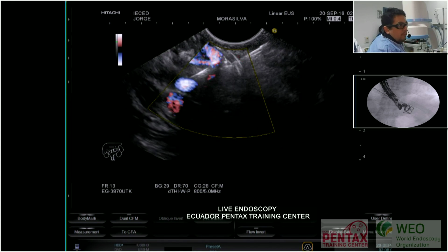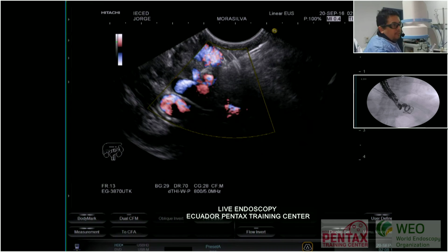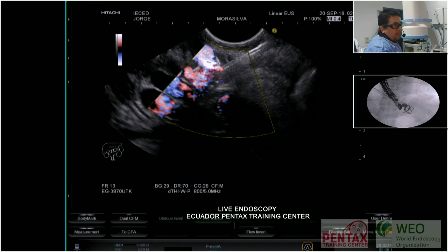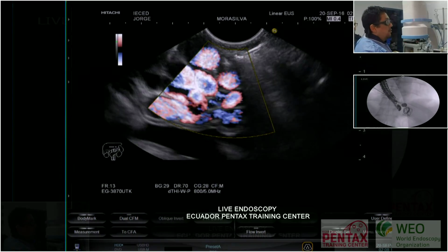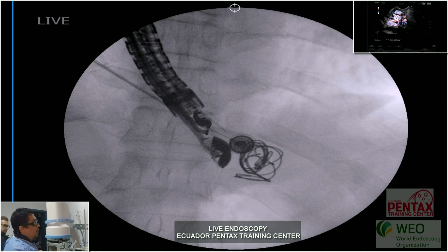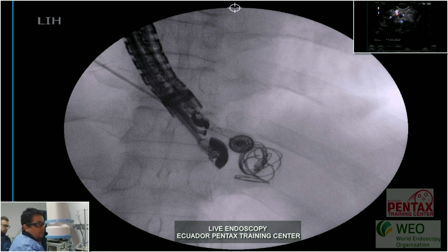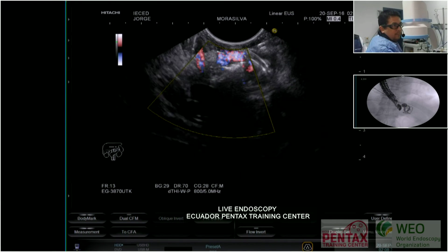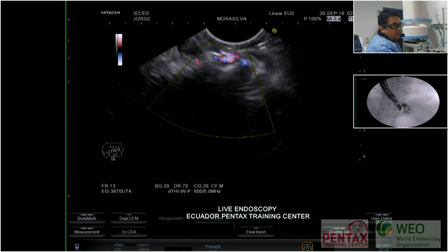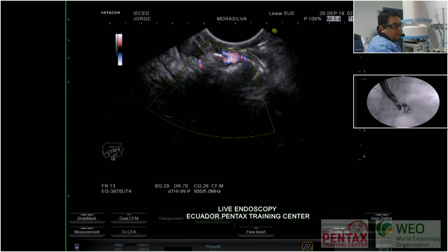So here you have less flux inside the vessel. This will be diminished in a few weeks and here is okay. So I can retire my needle now. And here you can see no more vessel here, okay? So this varix will disappear soon, okay?